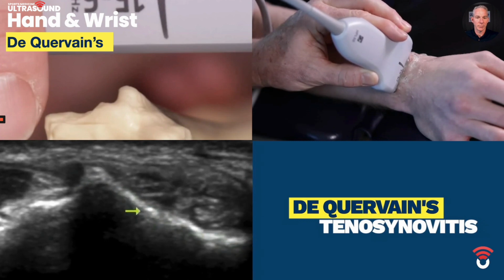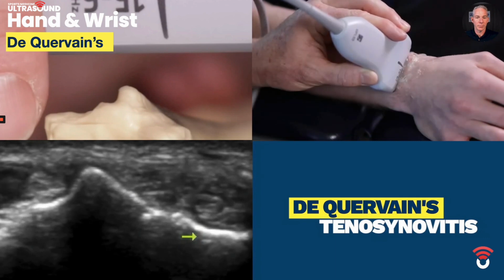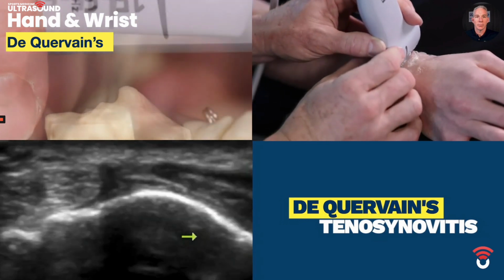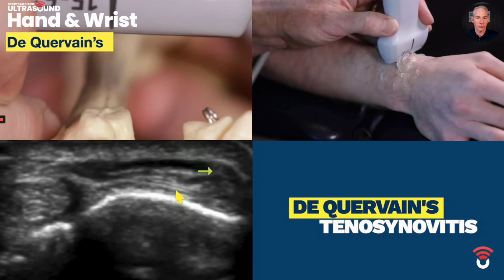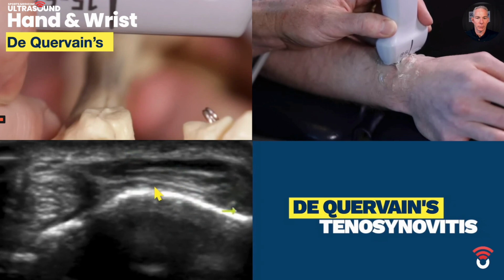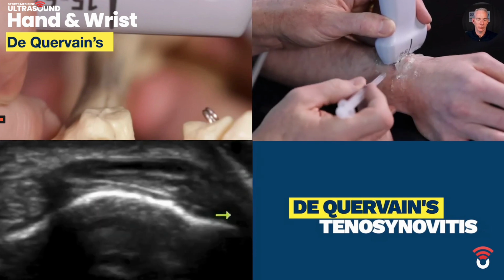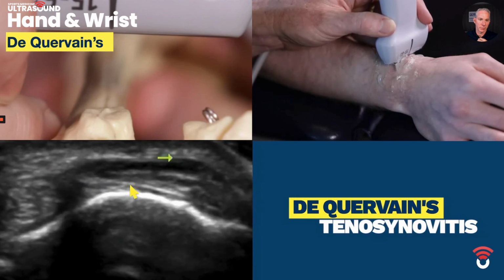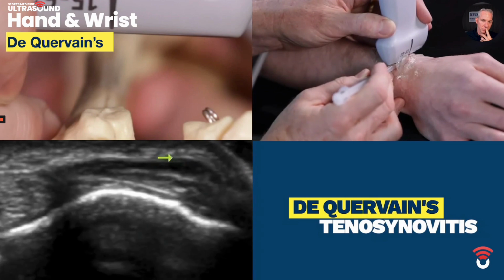And this whole length is the second extensor compartment. Quervain's is the first extensor compartment, so we'll come around the corner, and we're now on the first extensor compartment, with the two tendons of the first extensor compartment being highlighted by the yellow arrow. My needle entry angle is going to be like so, and my needle will land superficial to the tendon and subcutaneous right where the needle tip is.